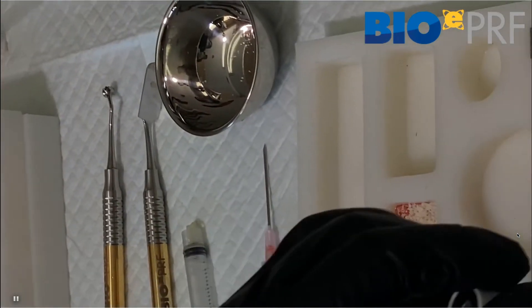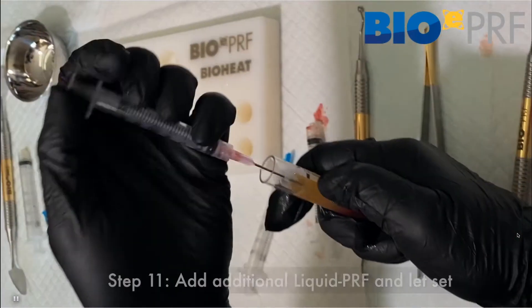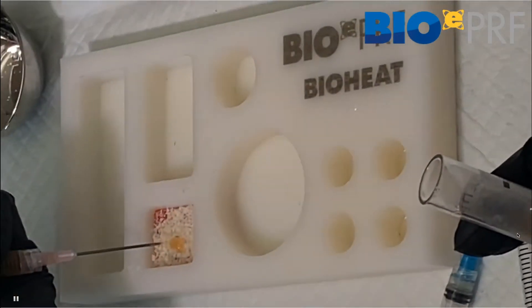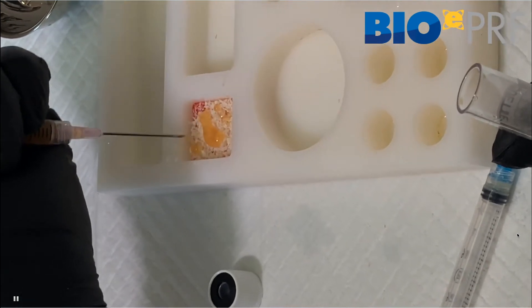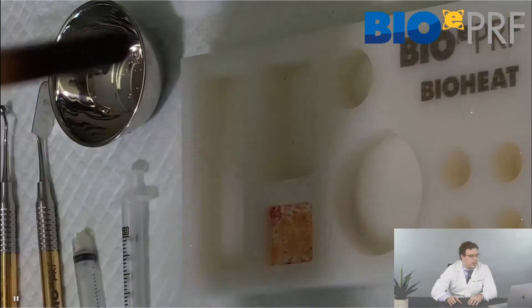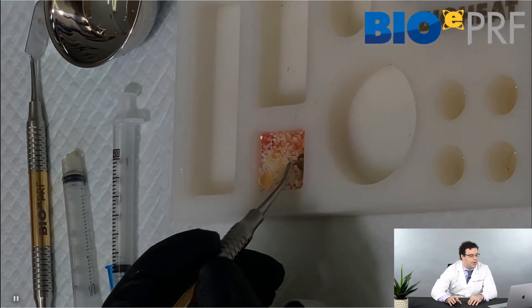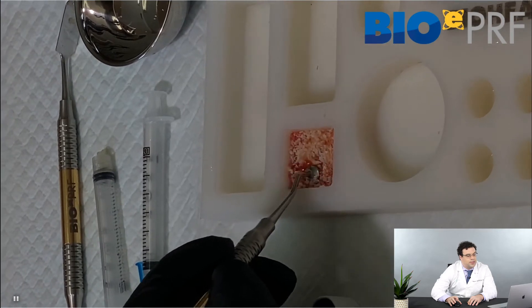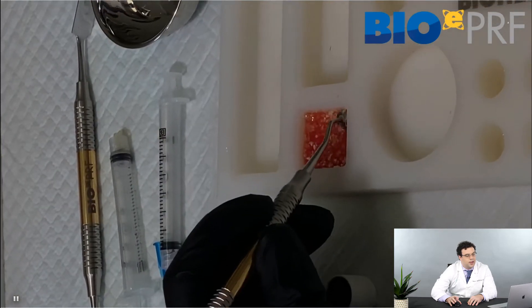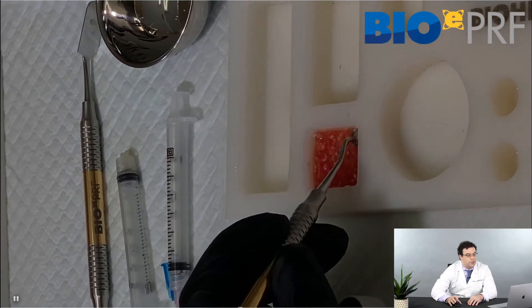You can extend the thickness based on how much you're going to load it. When that's done, you need to reintroduce the liquid platelet-rich fibrin. You're going to drop the liquid PRF — that's a normal standard liquid PRF tube, the white cap, the blue cap — and apply it everywhere. Then use the compactor to make sure all the allografts are incorporated. All you need to do following this is wait 15 minutes. This is something you can prepare at the very beginning of surgery and come back when you're ready.